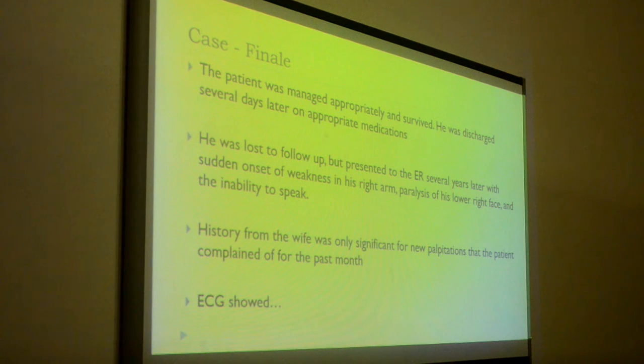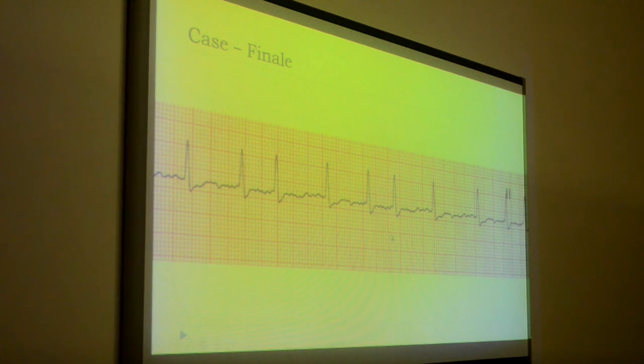Okay, what did this patient develop here? This is a stroke, exactly. A stroke in the brain. Okay. What's the relation between palpitations and stroke in the brain? Palpitations and stroke. Okay, let's see what the ECG showed. Who would like to start it off? AFib. Okay.